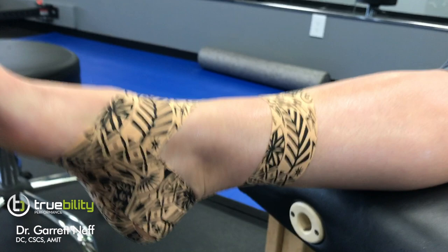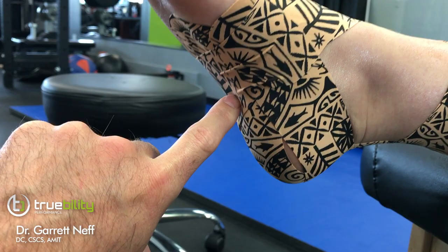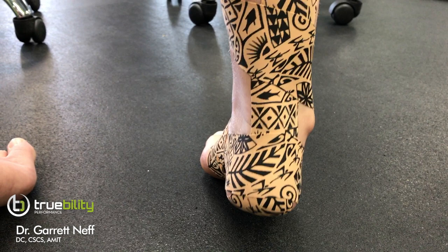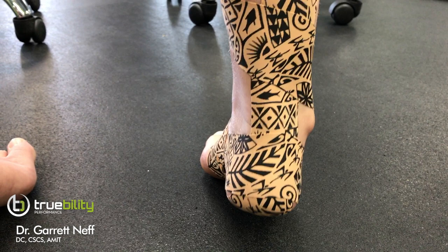In the video you can see how I've started here, come around the back of the heel, swooped underneath with this heel lock, and then pulled up and around and spiraled through. When she stands up — go ahead and stand up and face away and go up onto your tippy toes — this is what we know as inversion. This tape application helps with that rear foot or calcaneus lockout.